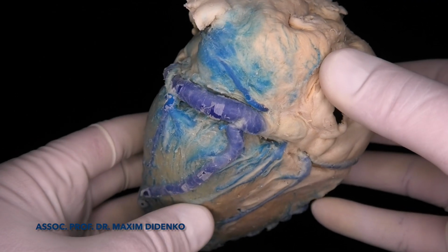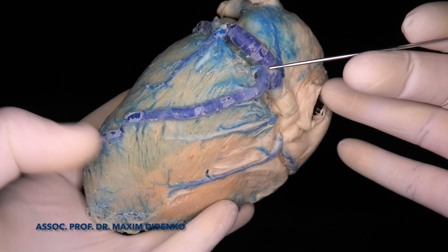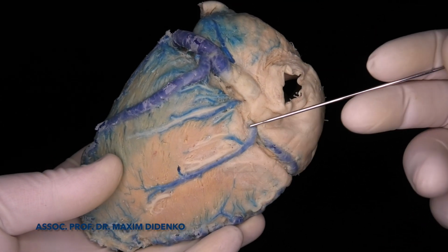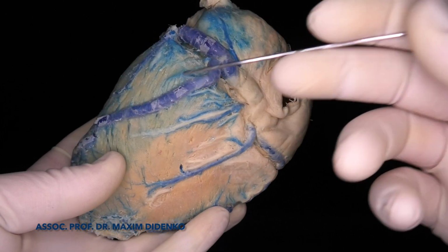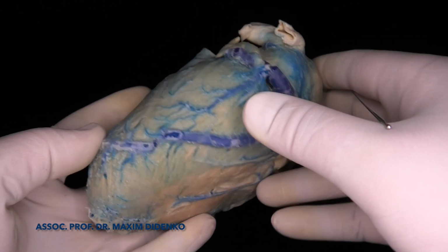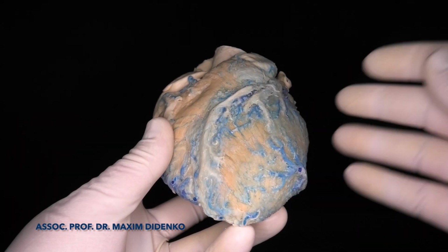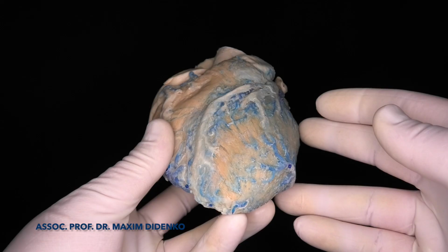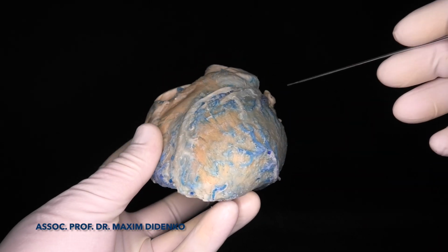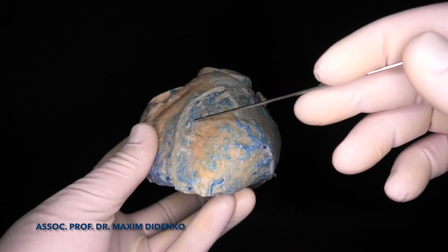So if we take a look at the other veins, you can see that they come from the surface into the coronary sinus directly or the great cardiac vein, and now we will see in a different projection how they look. If we take a look at the LAO projection, then we can divide them into the anterior interventricular vein.